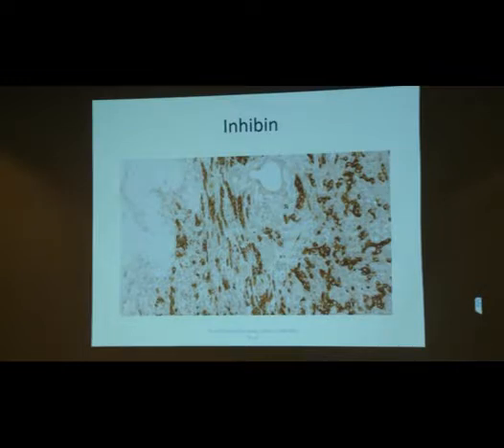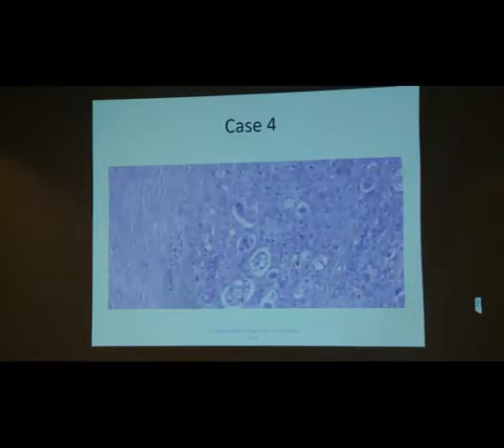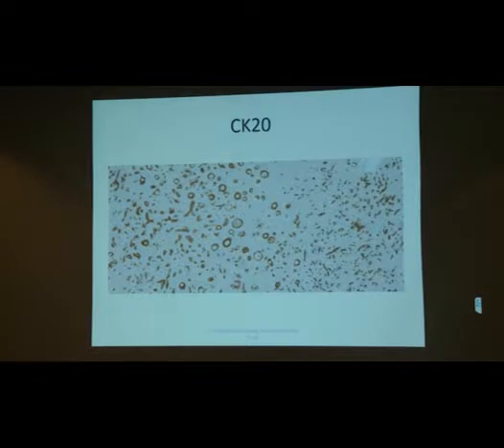It's only when I took extra blocks from this that we see this thing. So on one side the stroma looks paler, on the other side it looks darker. And now we're seeing some glands which appear to have vacuoles in them. And here's the CK20.